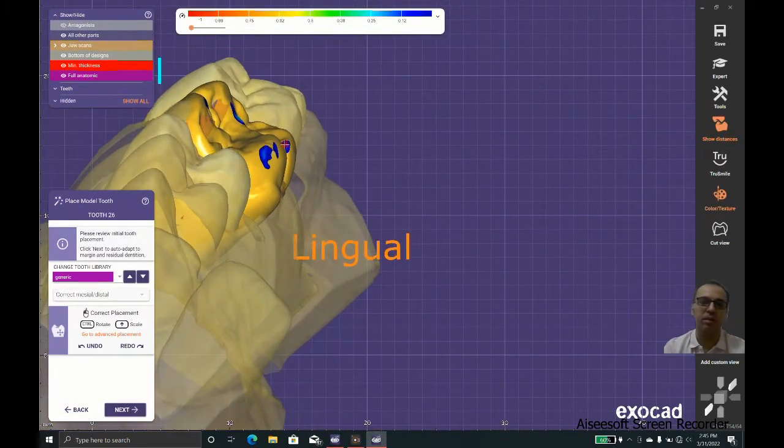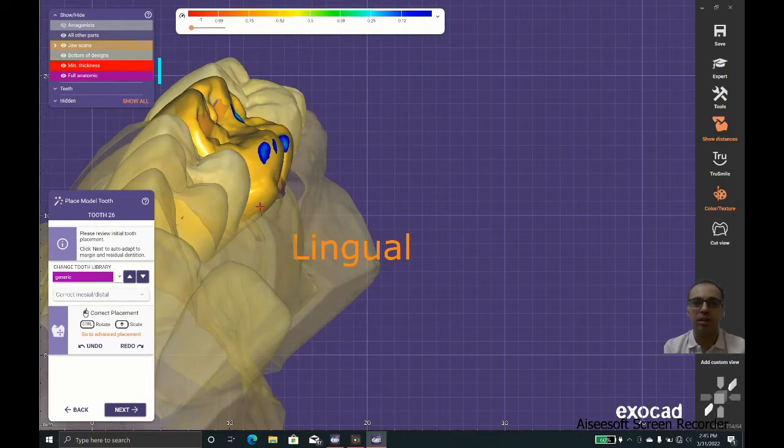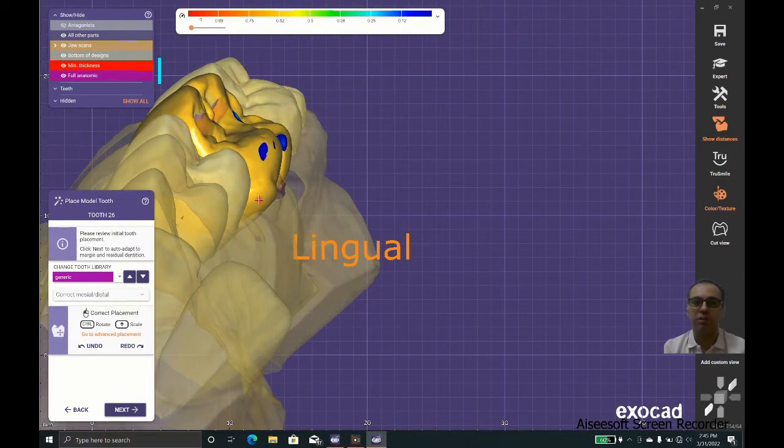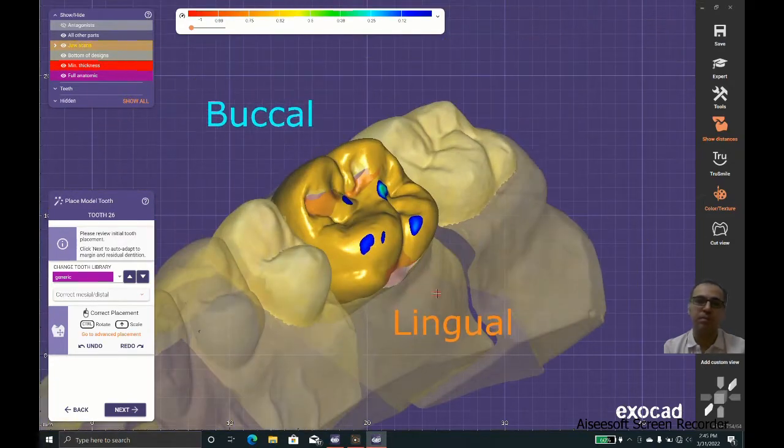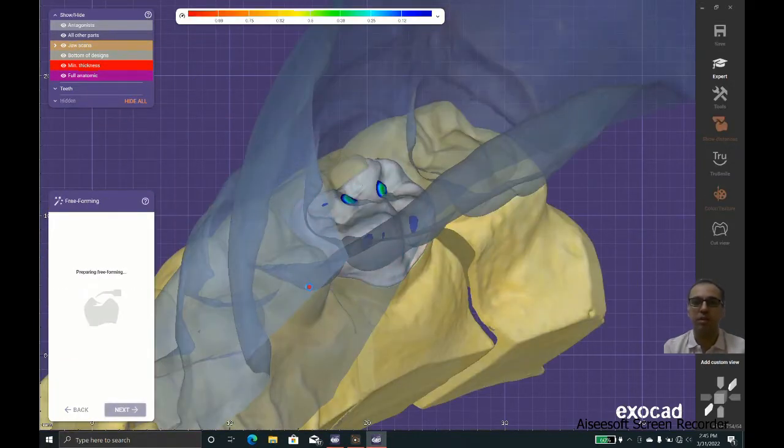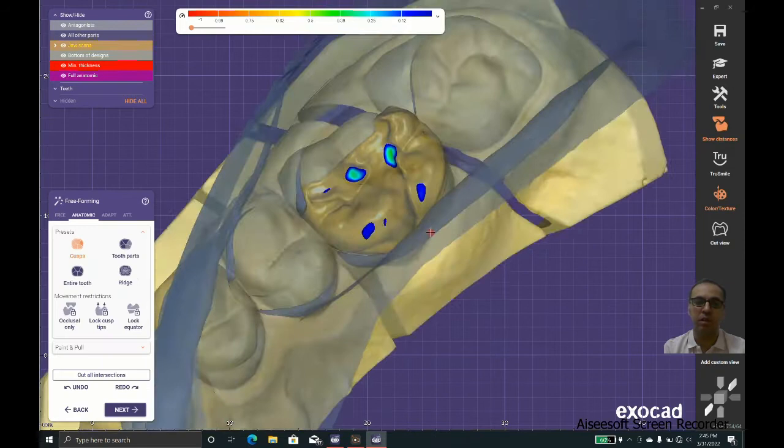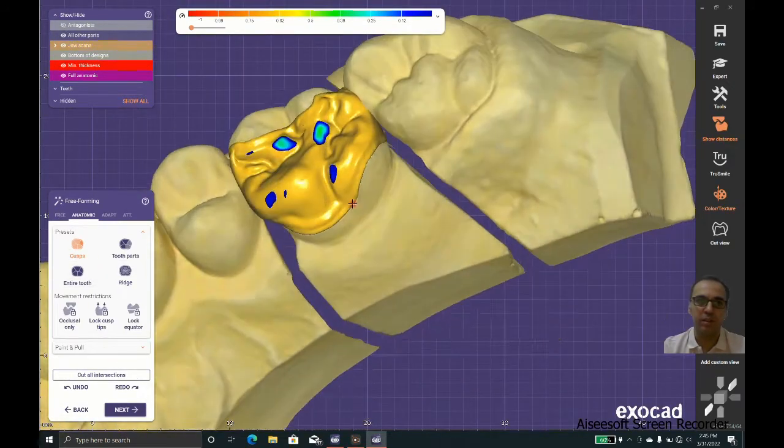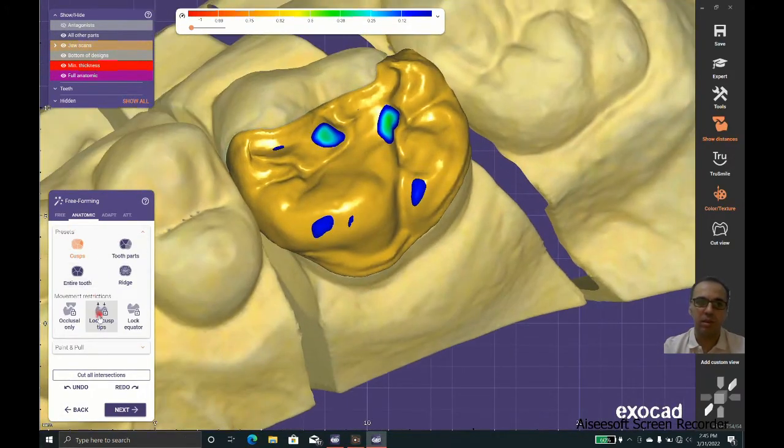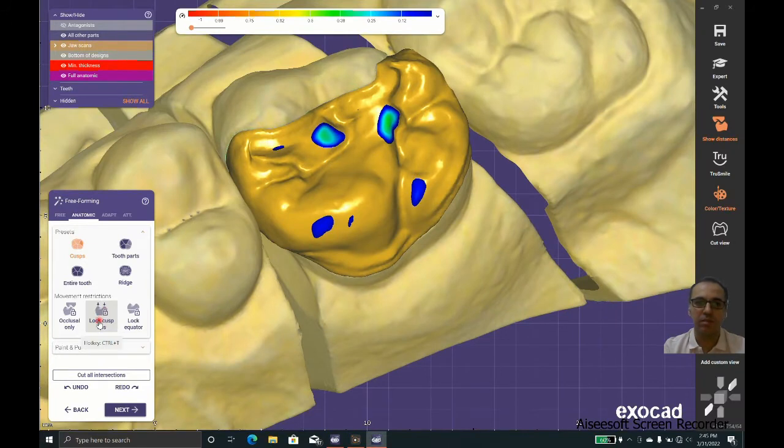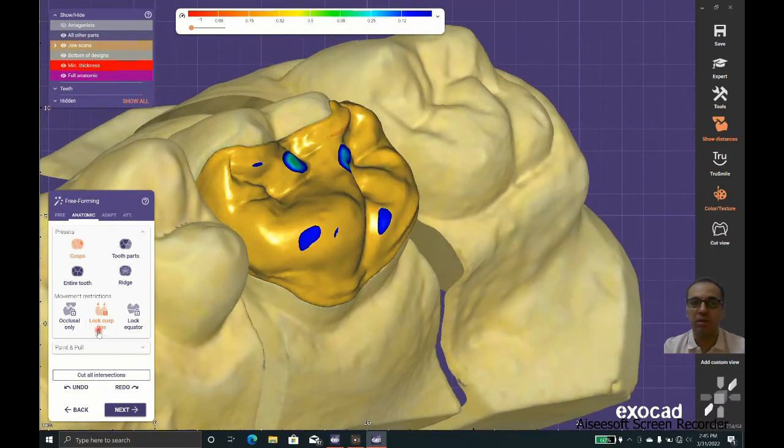We could scale the teeth so it fits better. We could use Shift for scaling and Control for rotating, and we let the software do the first renders. We could restrict the movements to occlusal or we could restrict the cusps.